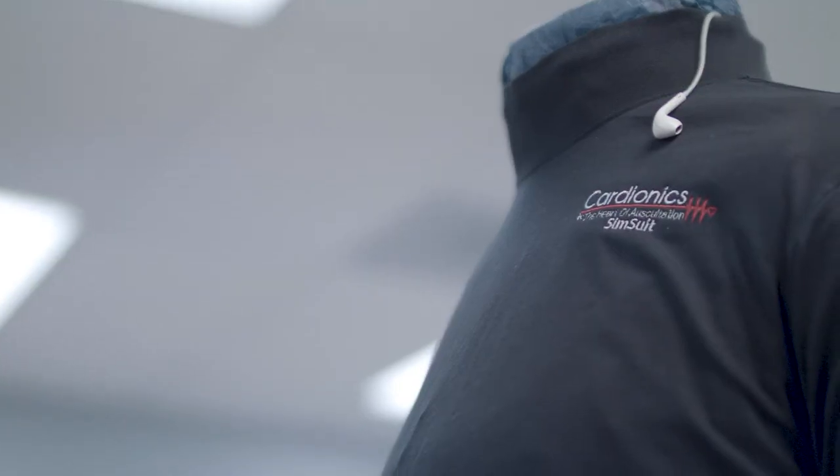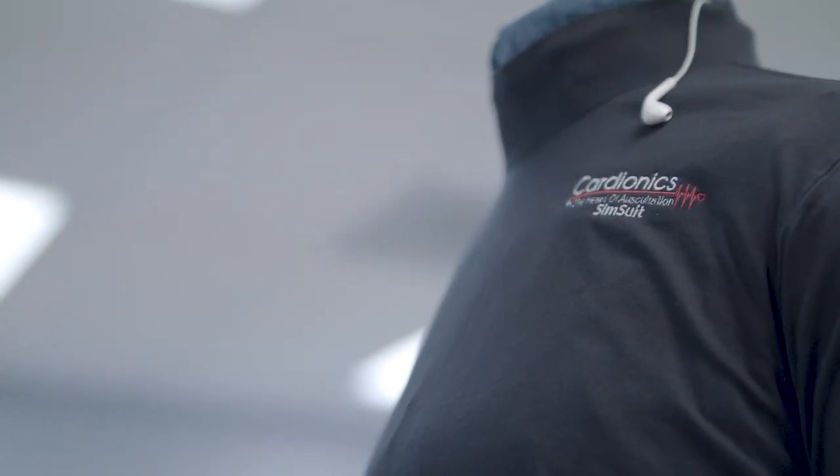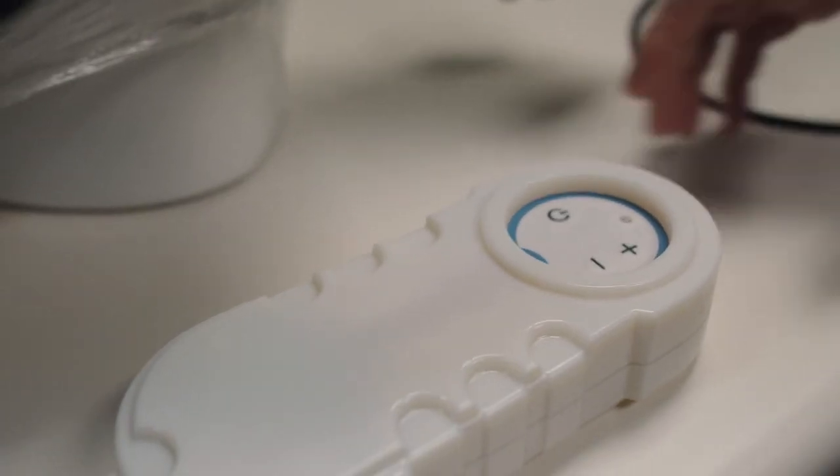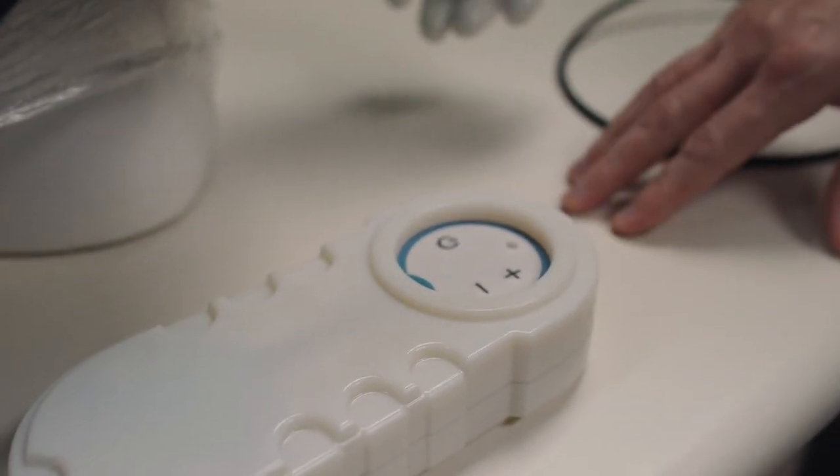In the past with the simscope we used to rely on the institute's wireless access points. With the sim suit design, we decided to make it the access point itself — the tech pack has everything, and devices log into it, so you don't have to rely on any institute infrastructure for it to work.